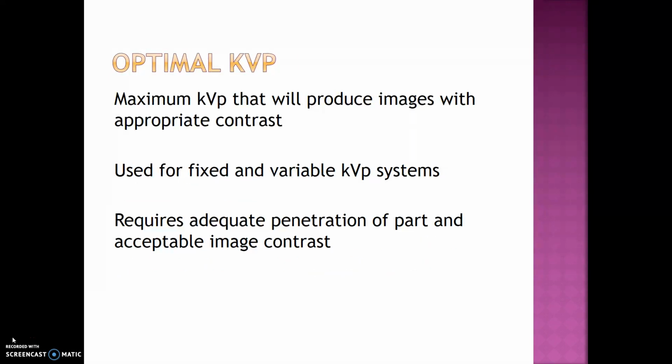The maximum KVP that will produce images with appropriate contrast is known as the optimal KVP. This is used for fixed and variable KVP systems. It requires adequate penetration of the part and acceptable image contrast.